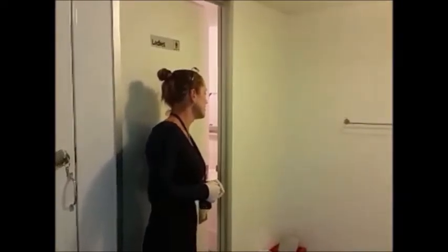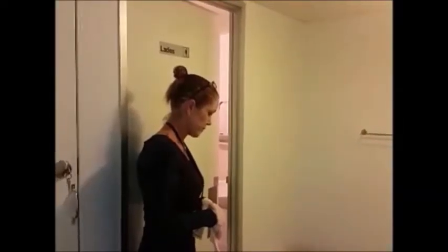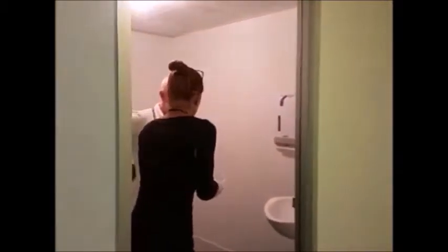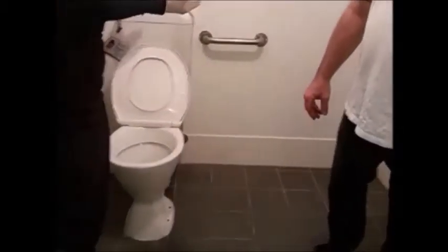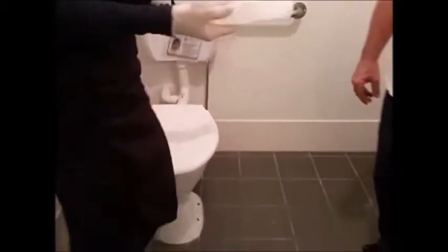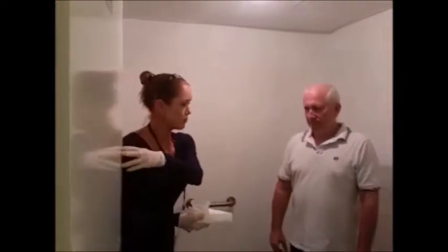Don't flush. No worries. Okay, I'm done. Okay, wonderful. Well, look, thank you. Just while you're in here, I'm just going to double check in the toilet as per NATA requirement. Things in there. I'll flush the toilet. Everything's all normal in here. Wonderful. I'm just going to check the temperature.